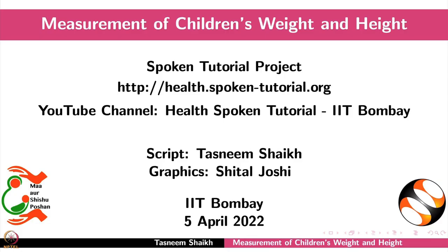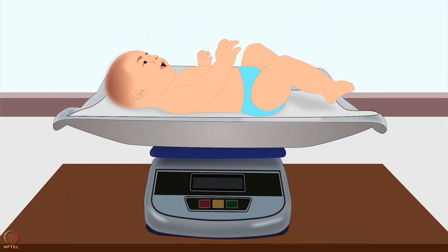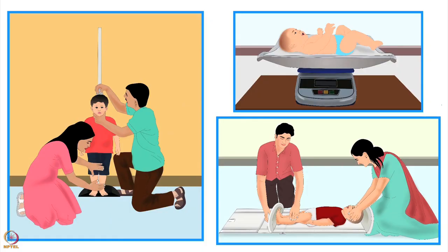Welcome to the spoken tutorial on the measurement of children's weight and height. In this tutorial we will learn how to measure a child's weight using the salter scale, how to measure a child's weight using a digital scale, and how to measure a child's length or height. Anthropometry is the most frequently used method to assess nutritional status.